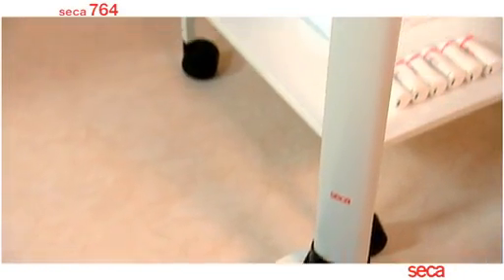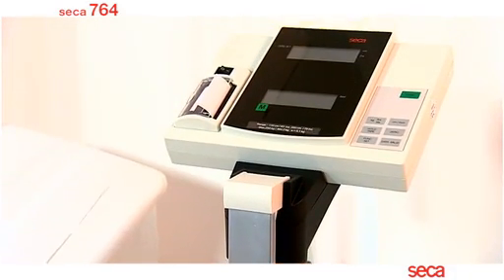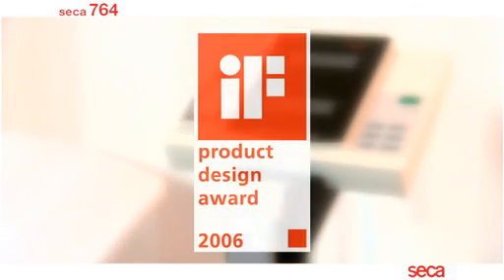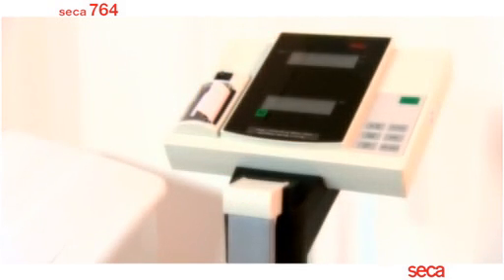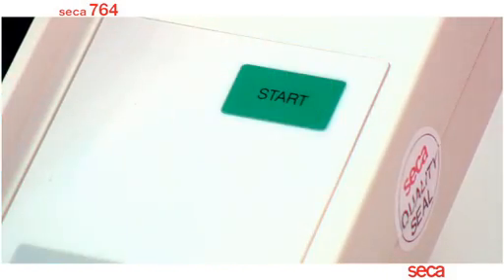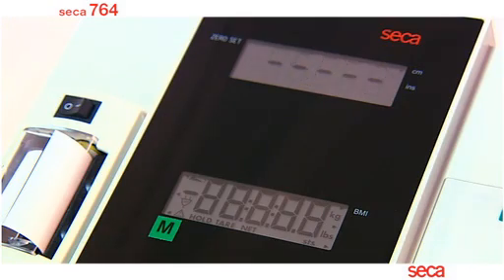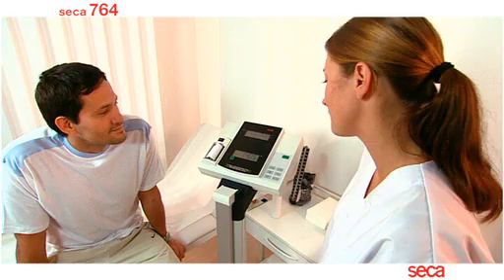An image of functionality and design, the Class 3 approved Sika 764 with integrated printer is the complete digital measuring and weighing station. The practical angle display incorporates an easy-to-use keypad, integrated printer and two large LCD displays which are activated when the scale is turned on.